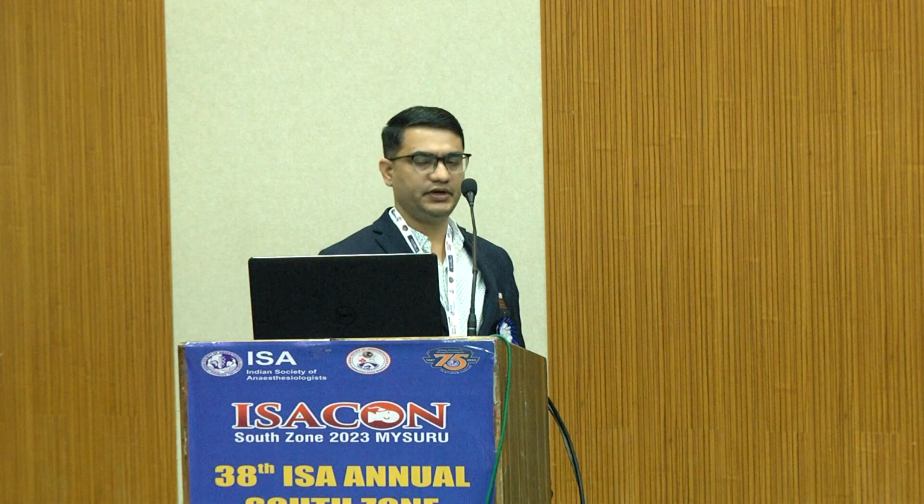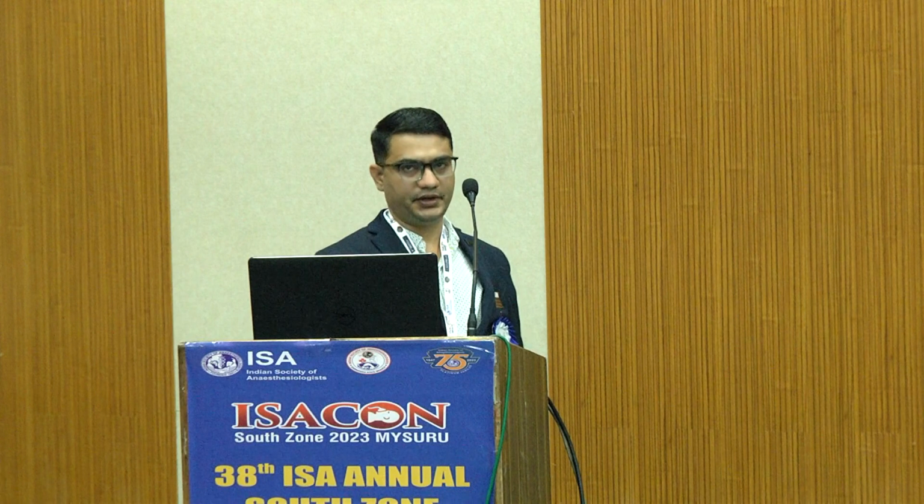So we all know that pulse oximetry revolutionized the monitoring of oxygenation. Of course, it's not ventilation; it's how to monitor the oxygenation. It is a non-invasive technique. It's a part of the ISA minimum mandatory monitoring. Whether you are doing a general anesthesia or NORA, it's mandatory. It's often regarded as a fifth vital sign.